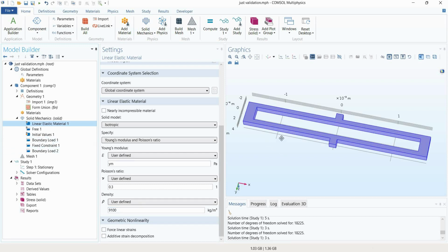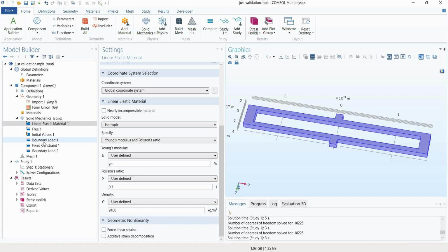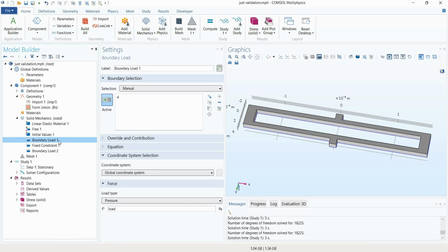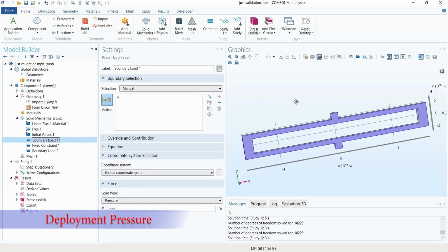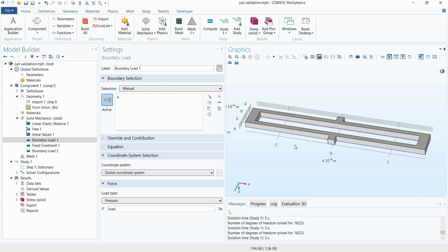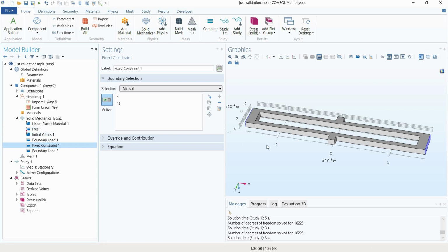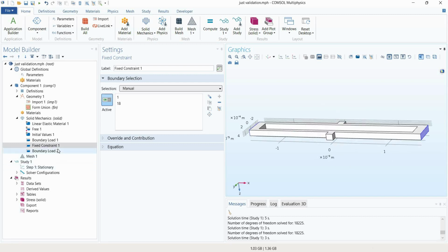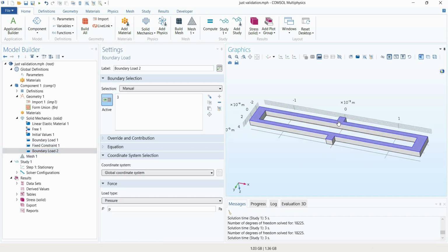Then for applying the boundary load, right click on solid mechanics, and you can see the boundary load, just select it. For applying the boundary load, we have selected the bottom of the design, and then we have taken a fixed constraint. For the fixed constraint, we have selected this face and this face, as you can see. And for outer wall pressure, we have selected boundary load 2 and selected the upper part of the Stent. Then we have done meshing, extremely fine, you can see here.